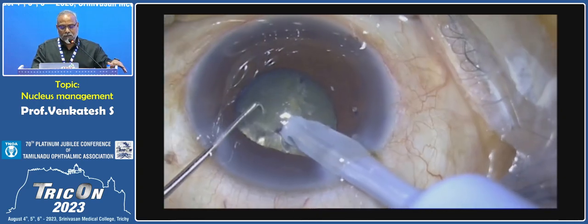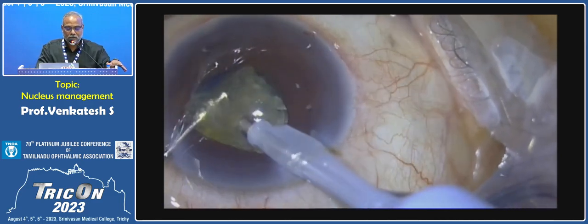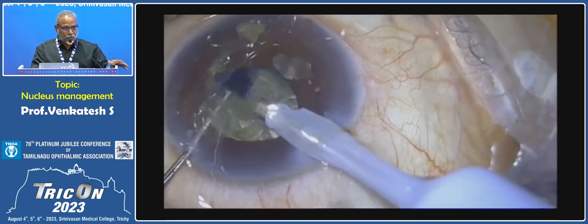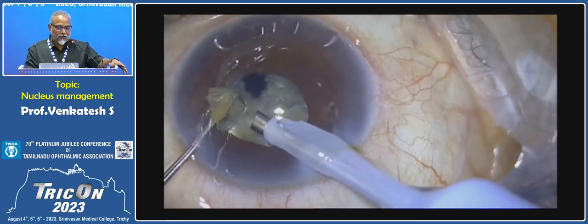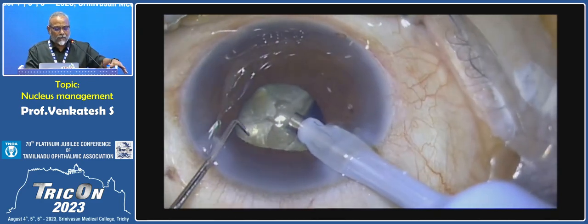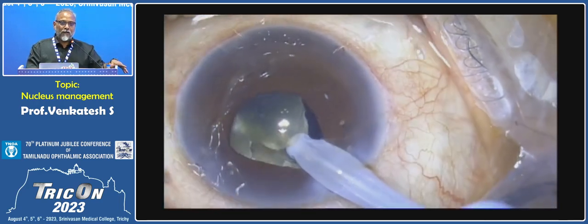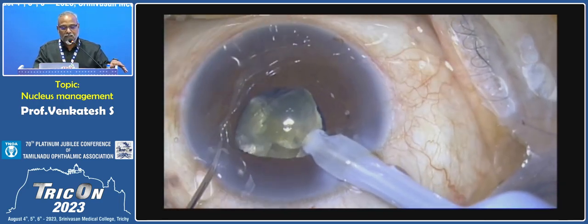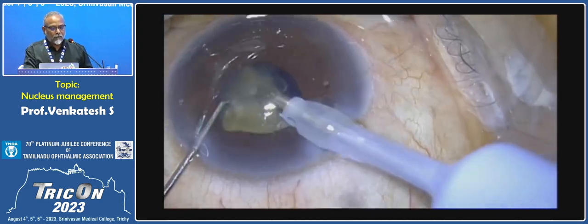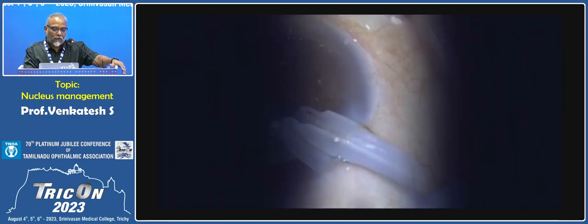Also, you see that in these harder grades of cataract, I don't break the nucleus just into four quadrants. The harder the cataract grade is, the larger the endonucleus becomes. So if you create four fragments, then all fragments will be large. So I create at least six. It will be better if you do even seven or eight, because each fragment then becomes a sizable small pie, which can be removed, brought to the central safe zone, and then emulsified using the parameters.